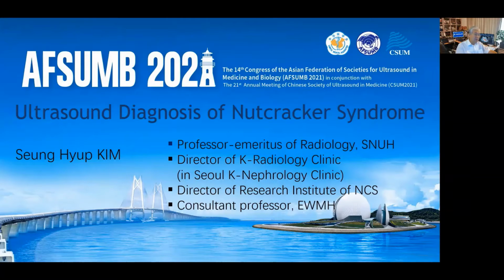This K Radiology Clinic is a part of Seoul K Nephrology Clinic, and we are taking care of a lot of Nutcracker Syndrome patients. Today, I want to share my experience of ultrasound diagnosis of Nutcracker Syndrome.